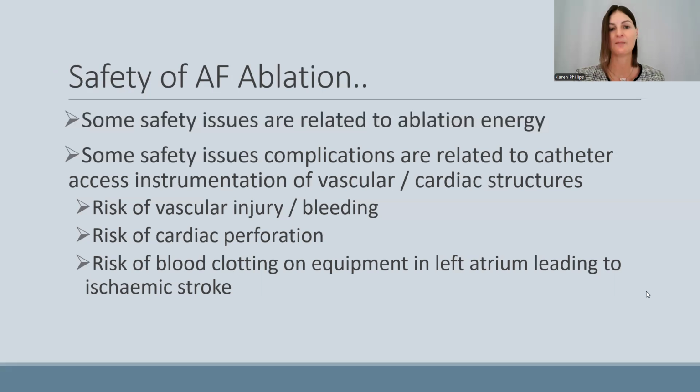So these other types of complications can include risk of vascular injury and bleeding, risk of cardiac perforation, and risk of blood clotting on equipment in the left atrium, leading to potentially ischemic stroke. There are differences between the procedures, and I wouldn't say at the moment that pulse field ablation is definitely safer.